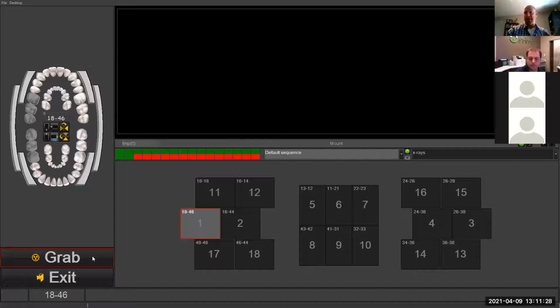Do you guys do FMX, or are you doing 4 bite wings? What do you do? I do both. Right now we're doing FMX with the pan.